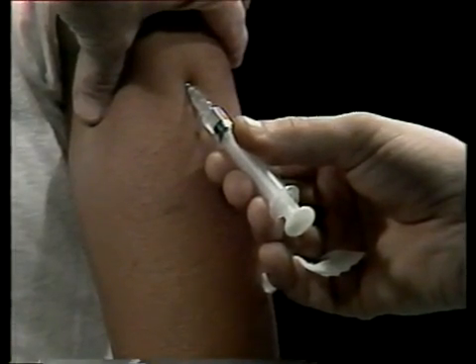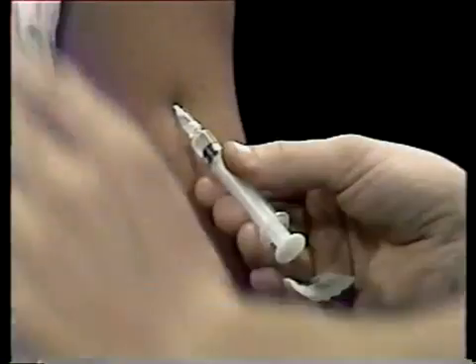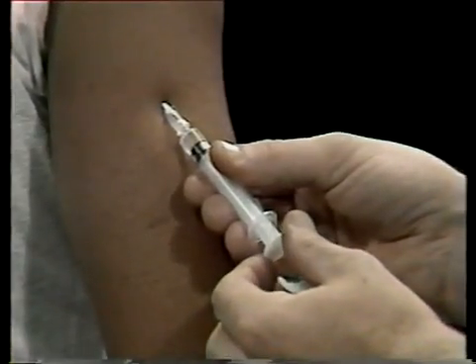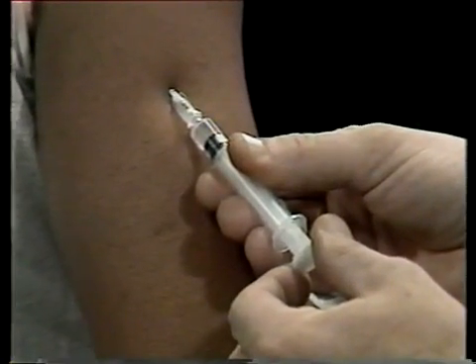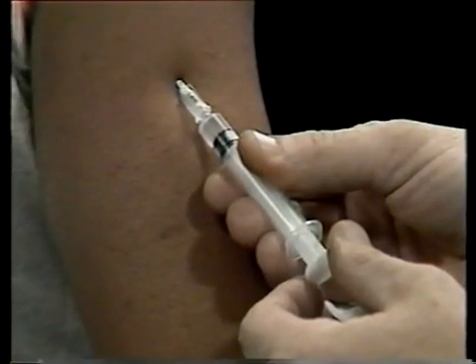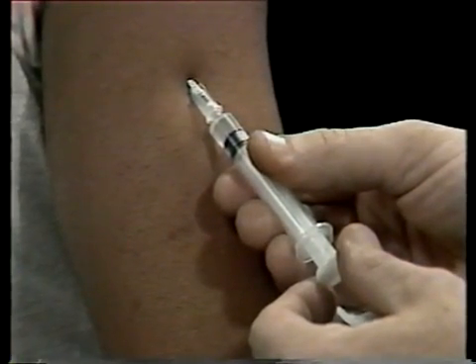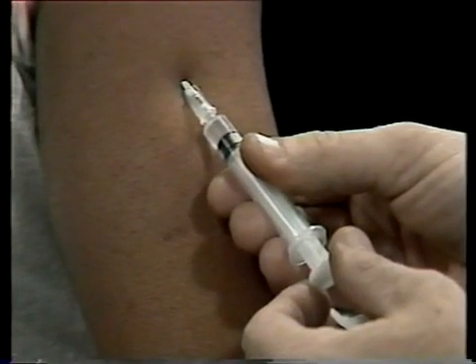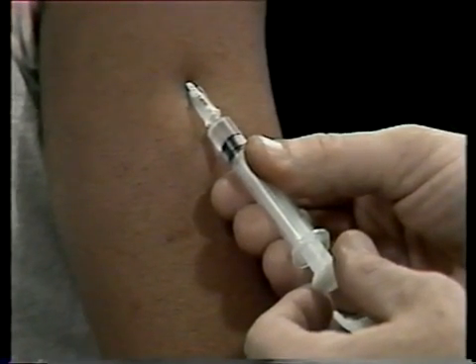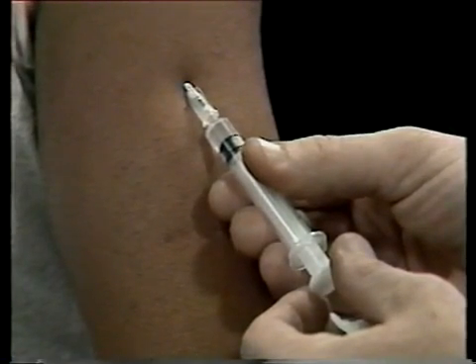When the needle has penetrated the skin, you can release your pinch and move your free hand to the plunger of the syringe. Now comes a very important precaution. The purpose of this type of injection is to introduce medication to the blood-rich tissue under the protective skin, but you never want to inject medication directly into a blood vessel. The medication might injure the blood vessel — it could even cause shock.